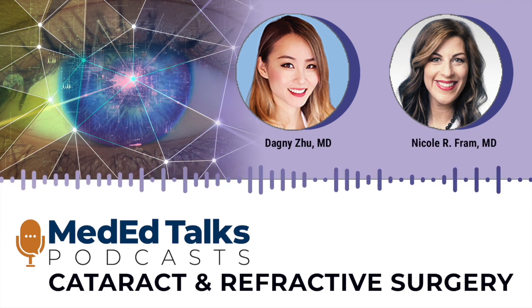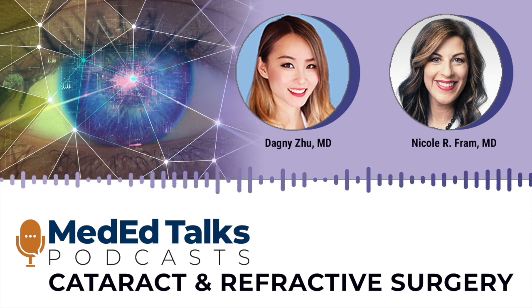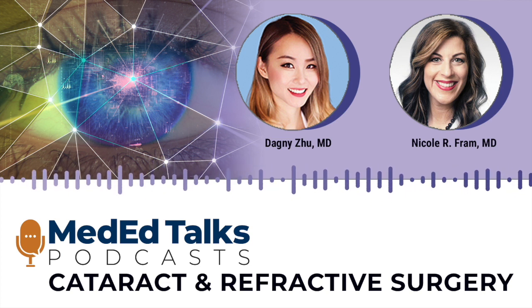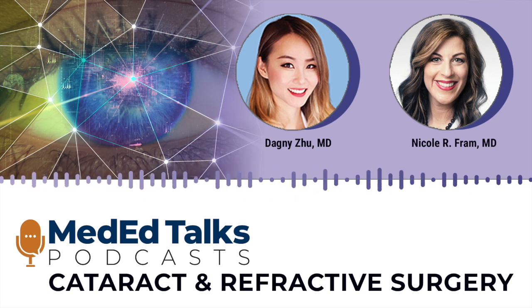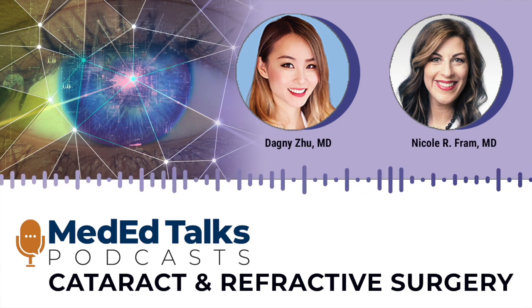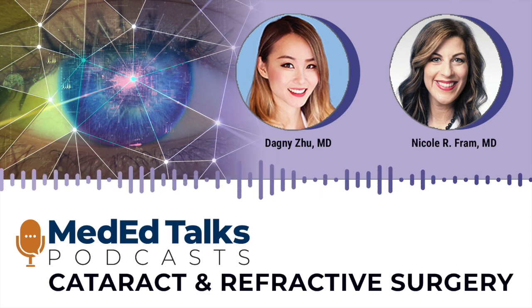And then also overlays over the eye itself of where you should place your main incision, and how large or where you should place your capsulorhexis, things like that. We have those currently with Verion and Callisto. The idea that you can use lens thickness and have triggers of when you're too close to the posterior capsule, I think those things will be very cool. That's probably coming sooner than we think, and the possibility of robotics. But we don't want to put ourselves out of business yet.